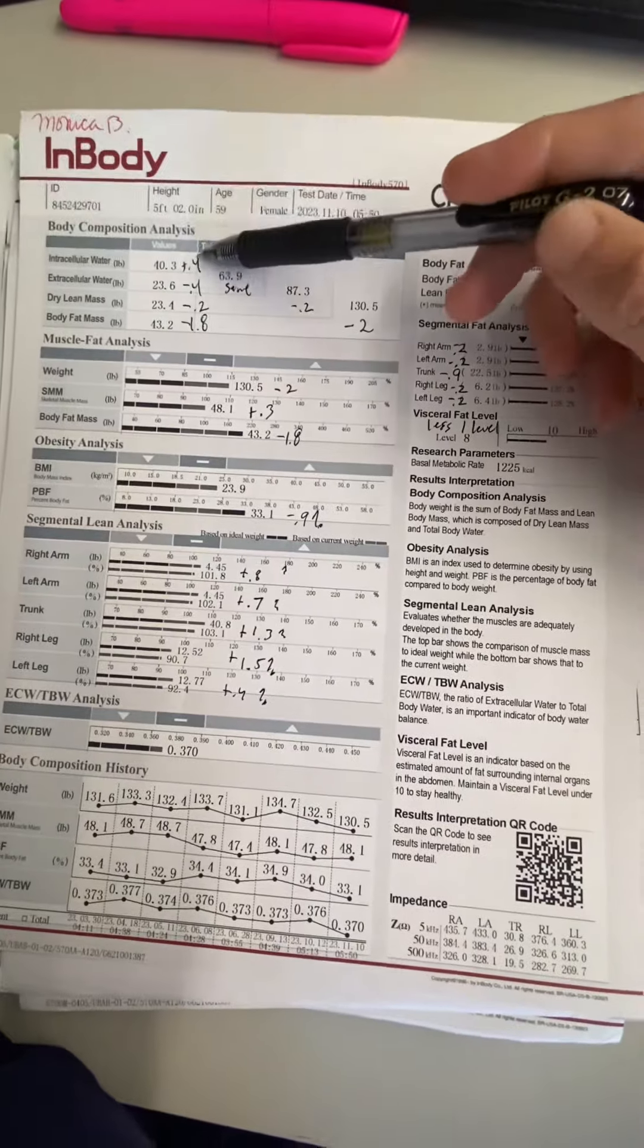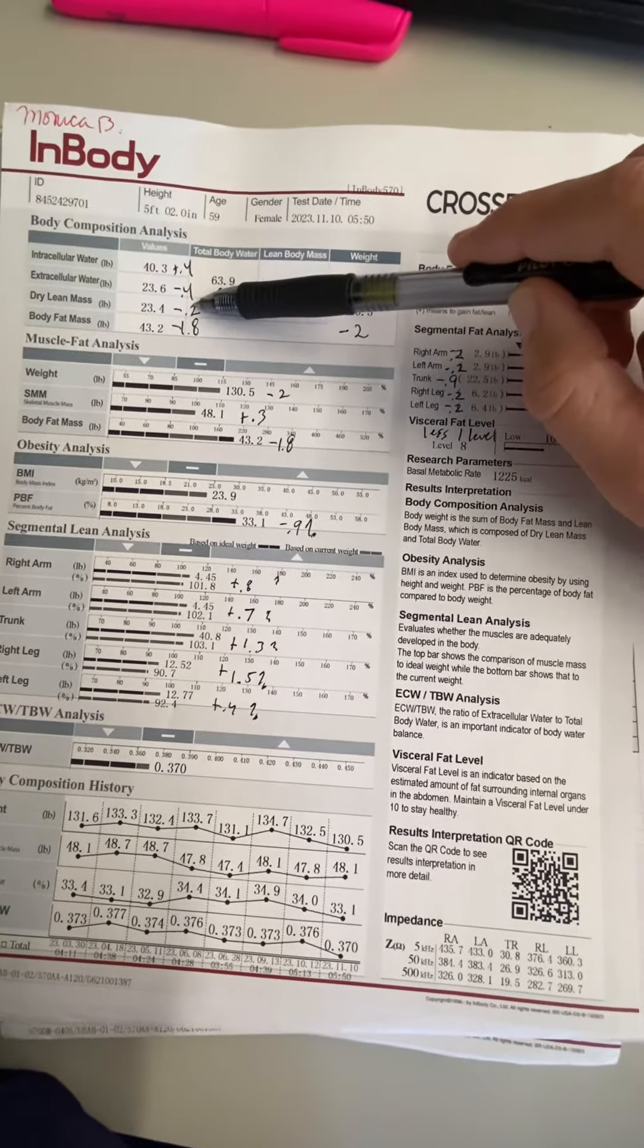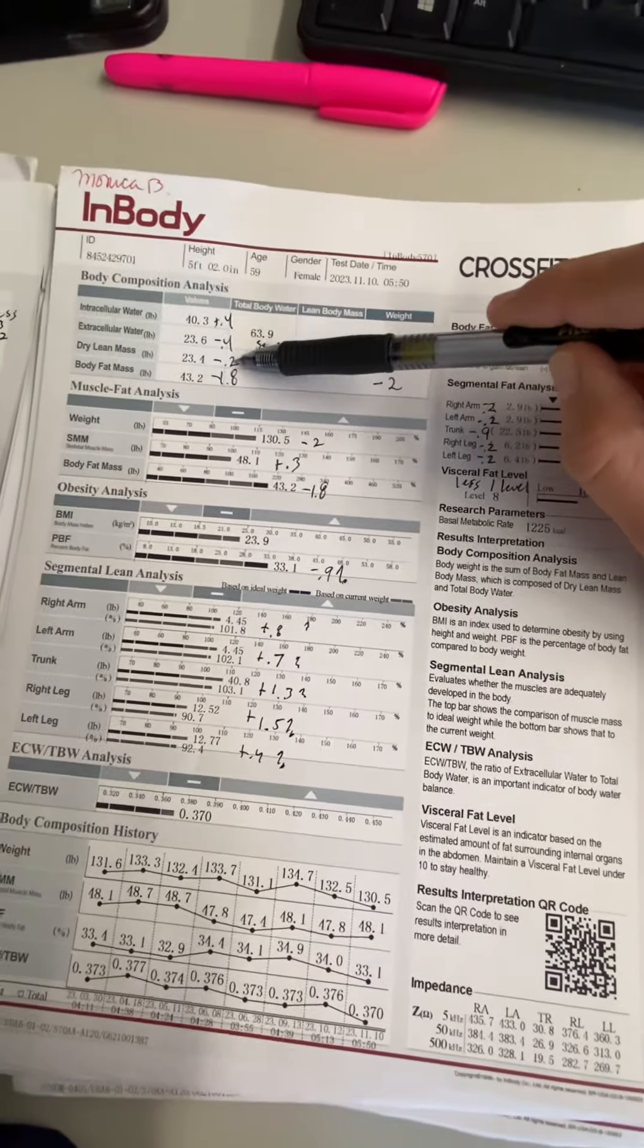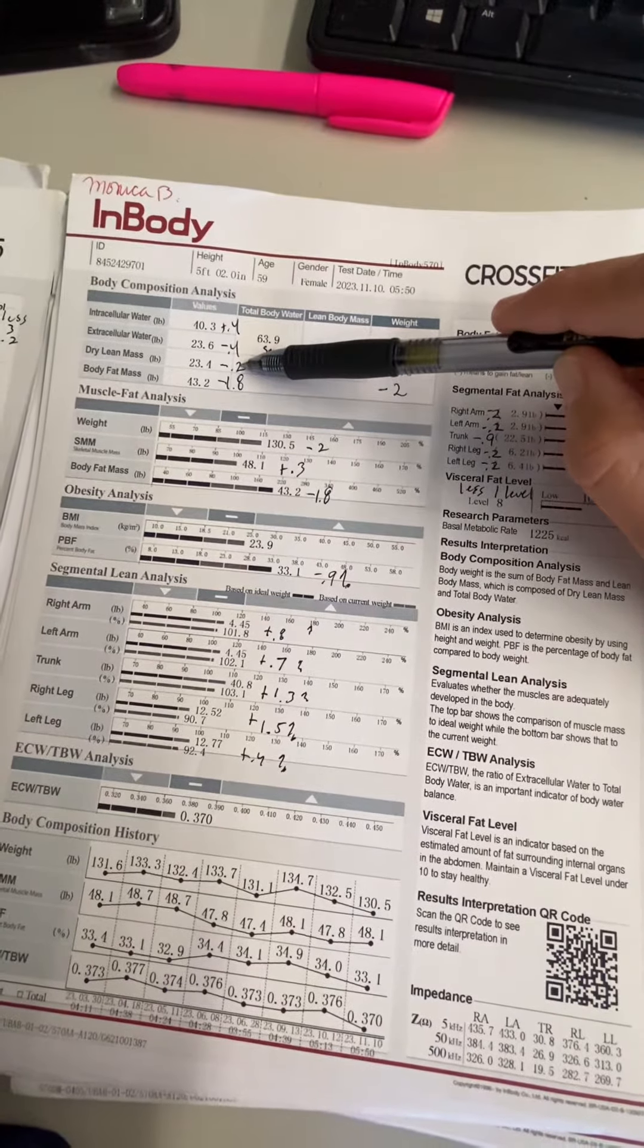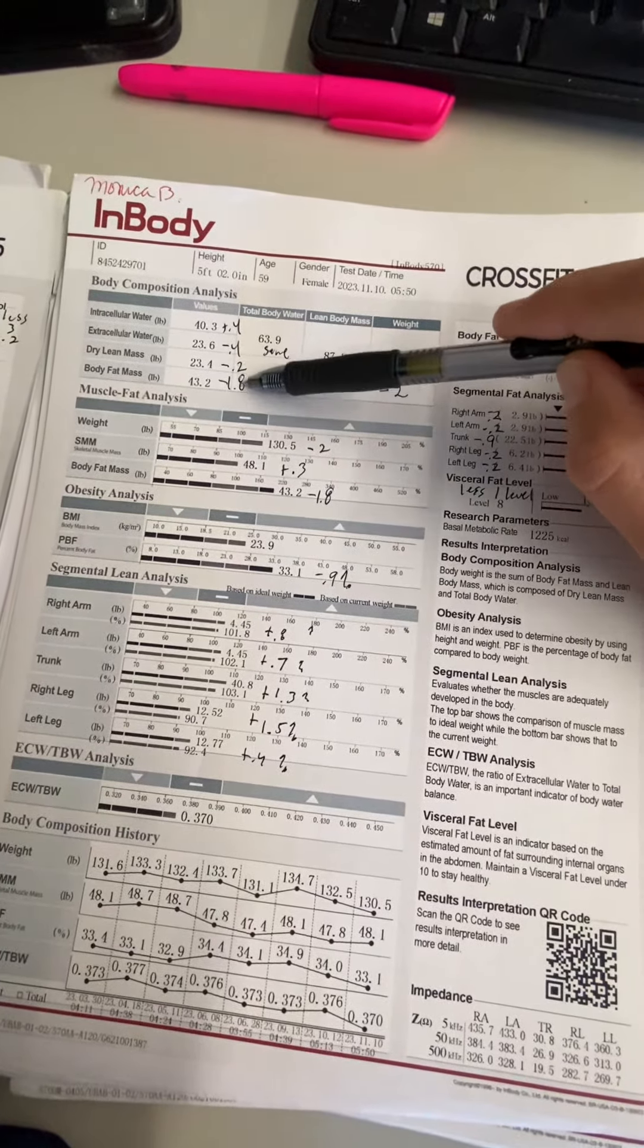But anyway, let's go over the numbers. So your water stayed the same and you did lose 0.2 pounds of dry lean mass, which is super insignificant - I'm not really going to worry about that. And you lost 1.8, almost two pounds of body fat since your last scan, which is great.